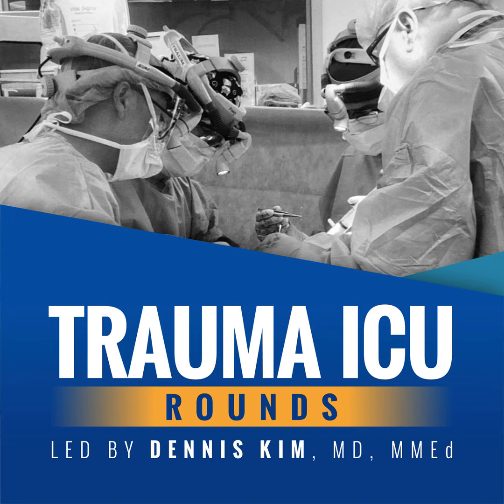There are disadvantages, however, and this includes the variation in volume and hence minute ventilation delivery, and the fact that conceptually it's a little bit more difficult to understand. For example, in volume ventilation, the tidal volume is determined by the product of the I time and the inspiratory flow rate. In pressure control ventilation, tidal volume is affected by several characteristics, including the delta or the difference between the set pressure and the PEEP, the flow pattern, the inspiratory time, as well as the contribution from time constants.